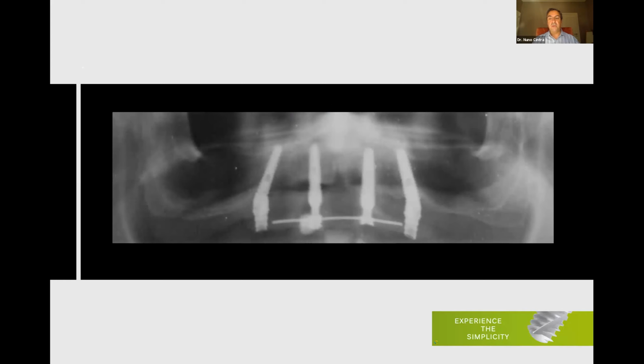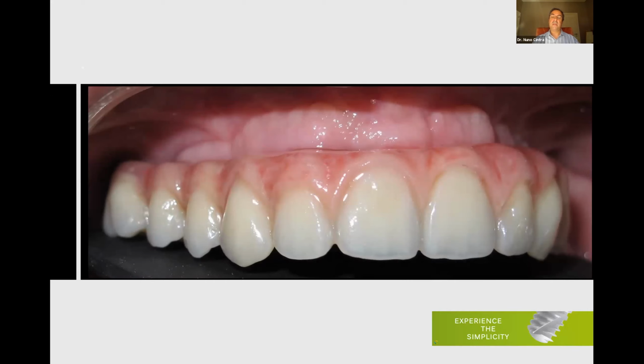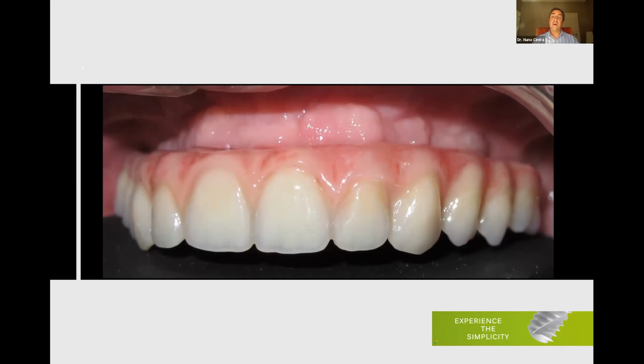Look at this case. Again, I reduced as much as I could. Can you see? Those are the nasal floors. I couldn't cut any more bone, but anyway, this is the result. Okay, and this angle between the bone and the gum and the prosthesis should not be more than 45 degrees. If this is more than 45 degrees, it will be very difficult for the patient to wear. It will be very difficult for the patient to keep it clean, and it will be very uncomfortable. But anyway, in this case, maybe I should have placed my implants a little bit higher, but I couldn't because I didn't have more bone to cut. So I'm not more than 45 degrees, but I'm at the limit.